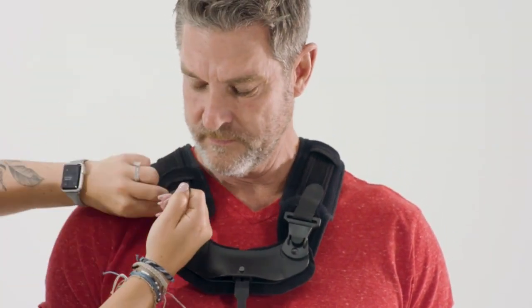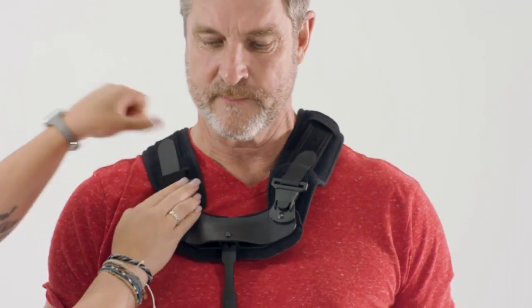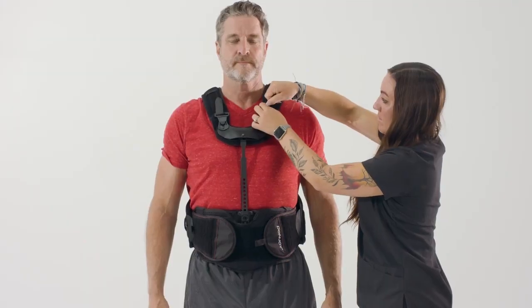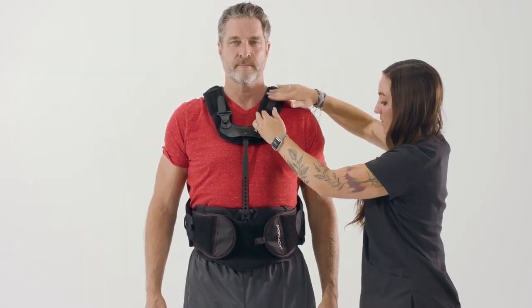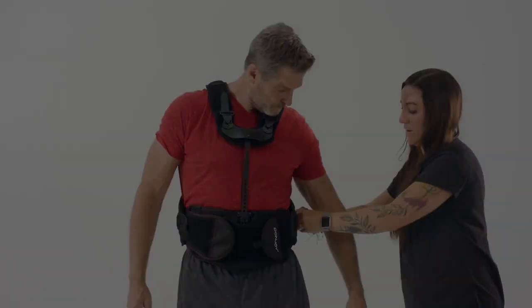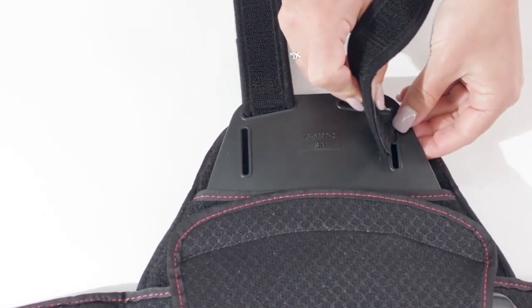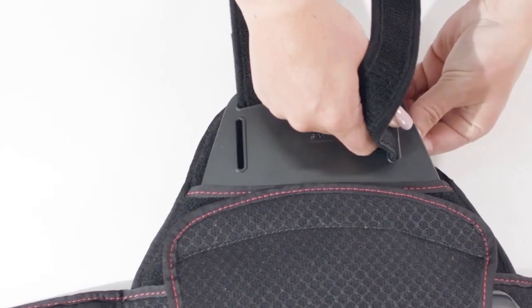To adjust the shoulder straps, release and adjust the posterior velcro straps first. Adjust to desired length, being sure to maintain the bottom edge of the front panel with the pubic bone and the back panel between the shoulder blades and lower back. If the patient prefers the underarm shoulder strap option, release the posterior velcro from the back panel and insert into the lateral strap slide. Adjust to desired length.